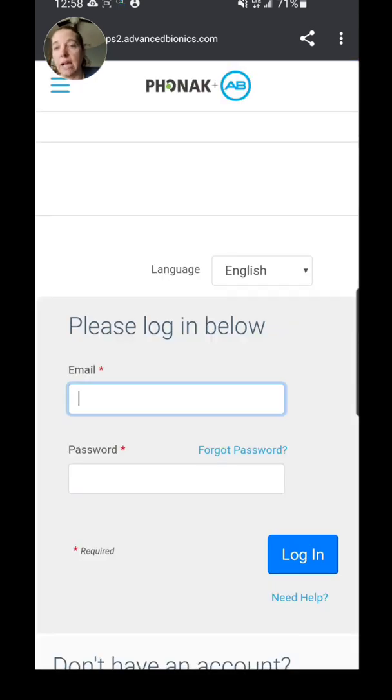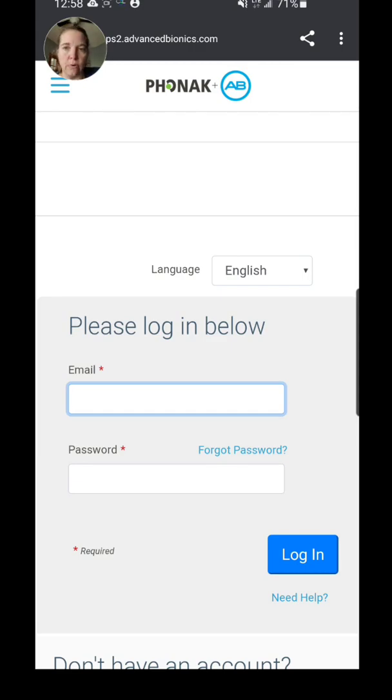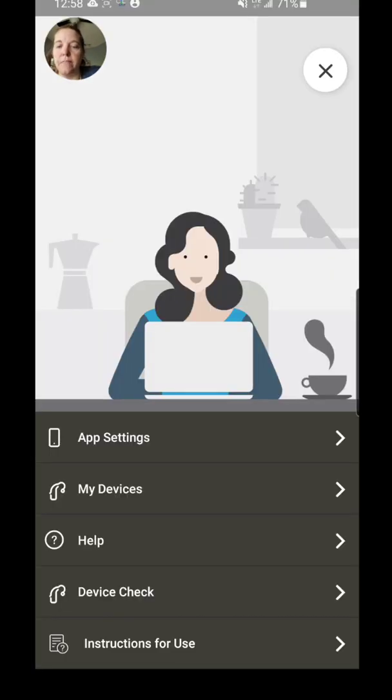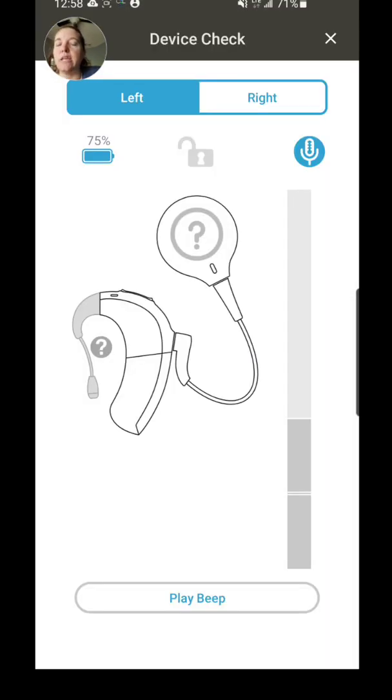This actually takes you to myabonline.com, which will give you access to all of the different troubleshooting guides and everything. You do have to have your login, so if you don't have an account with AB on myabonline.com, I suggest that you get that set up.